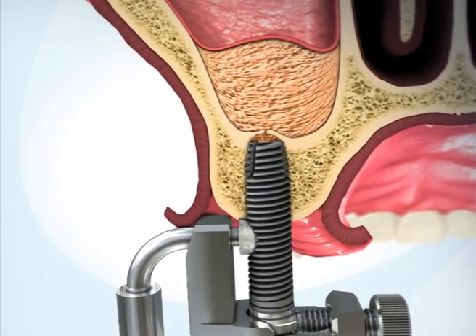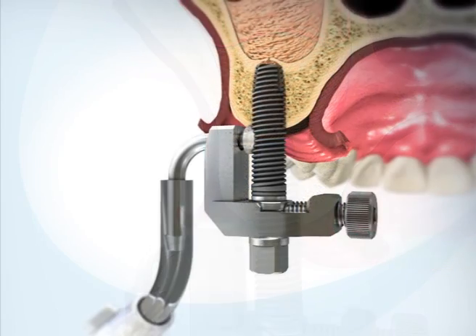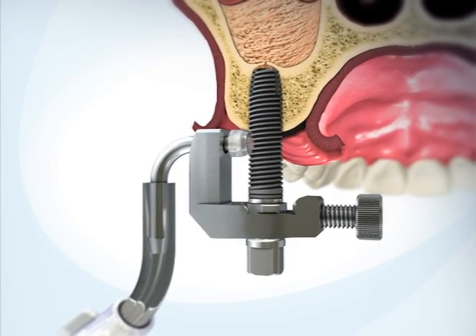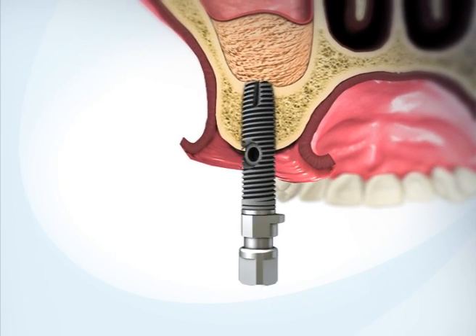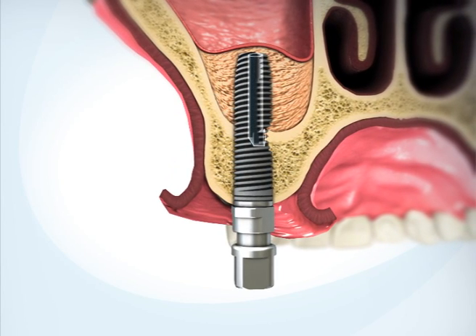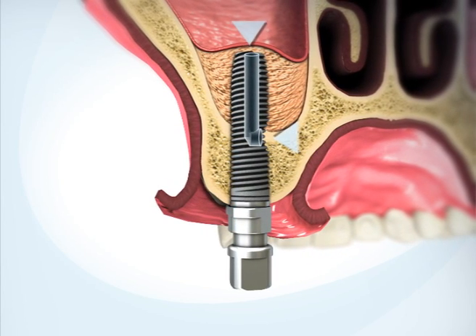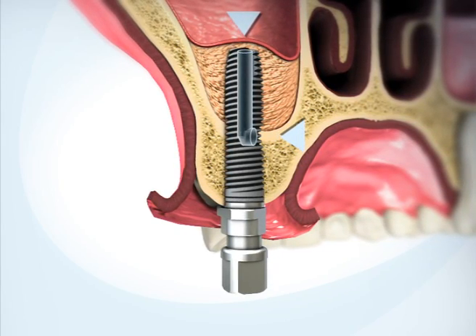Inject the bone graft into the sinus. Remove the adapter from the implant and insert the implant fully into the osteotomy. The novel design of the channel ensures that both openings are embedded within the jaw bone, thereby preventing bacterial migration from the oral cavity into the sinus.